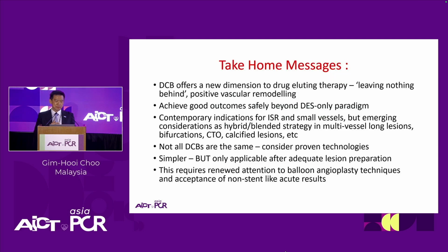So, ladies and gentlemen, DCB offers a new dimension to drug-eluting therapy. We want to leave nothing behind, allow for positive vascular remodeling. We know that we can think beyond just DES alone. We can achieve good outcomes safely. The indications for DCB were for ISR and small vessels, but have been expanded to a lot of other complex lesion subsets. But not all DCBs are the same.